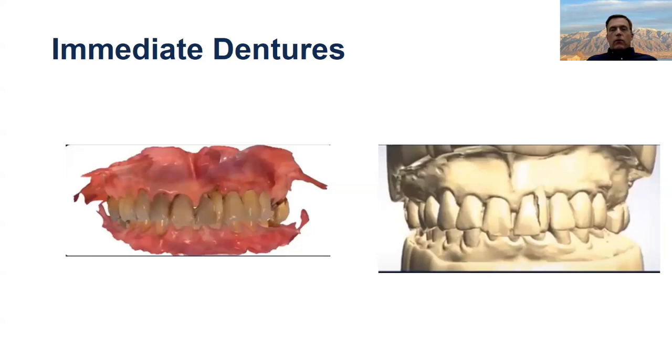If you want, we can extract the teeth digitally, which is nice. We can do a little bit of reduction if that's what you like. In general, in the laboratories, if you don't say what you want, we'll tend to remove the teeth right at the free gingival margin, so that in effect, when you do your extractions, there'll be a little bit of space inside there, because it sure is easier to fill the space with Lucitone than it is to grind it down.